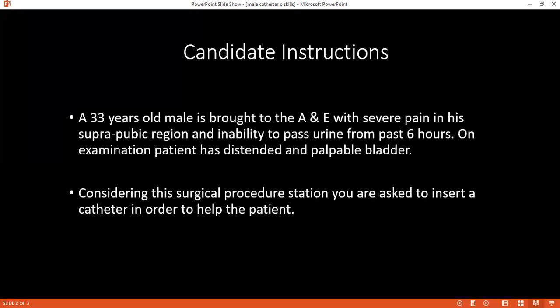I'll use a 14 or 16 size catheter. Okay, 14 size. And what syringes, how many do you need, and do you need them empty or filled? I need a 10 ml syringe filled with distilled water. Yes. And a urobag. Yes. And a dish for collecting the urine. Okay. And then I'll position the patient flat on the bed. Then I'll start the procedure.